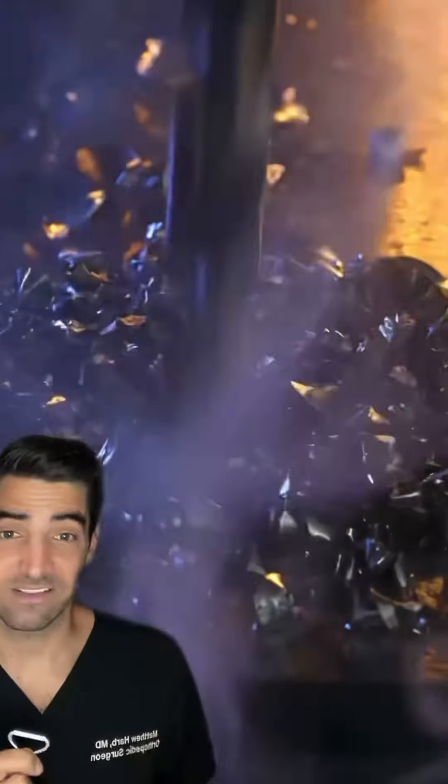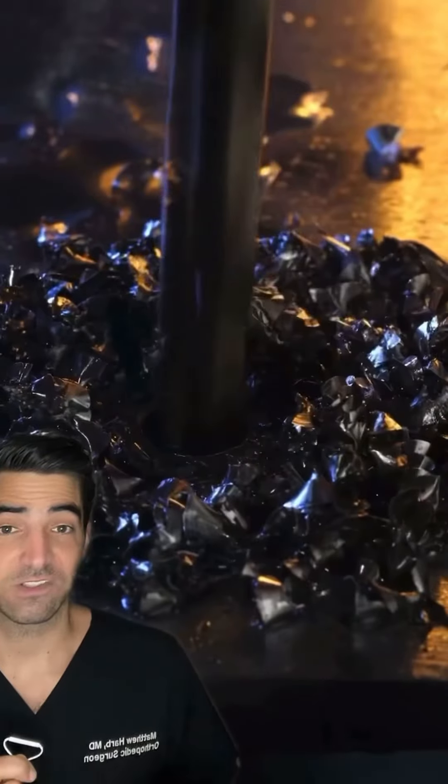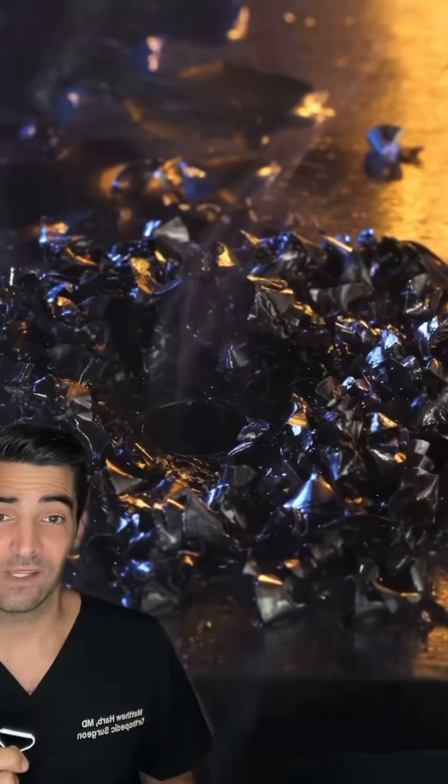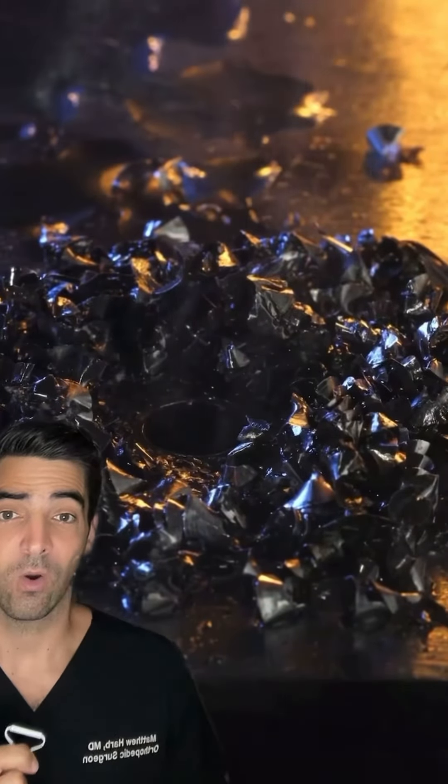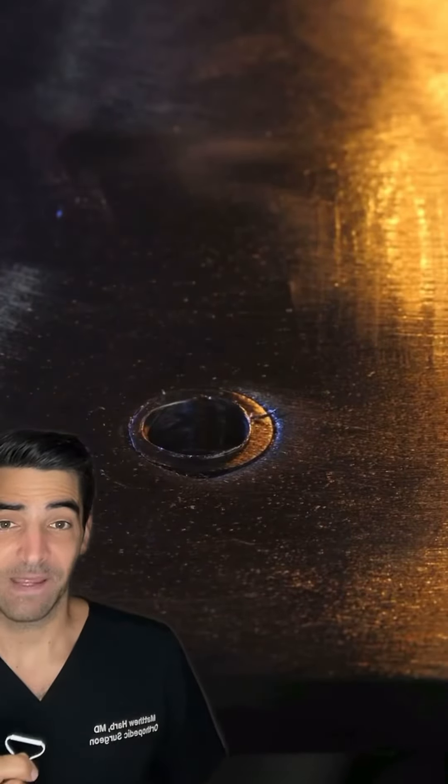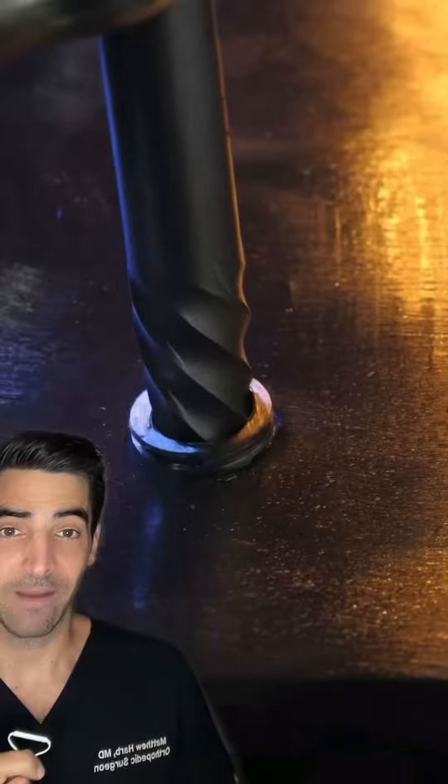So this is another technique. If the screw is stripped, you could drill into it and create a new hole. After that new hole is created, you could use a reverse threaded drill bit, and this basically will screw into this hole and you go in reverse.